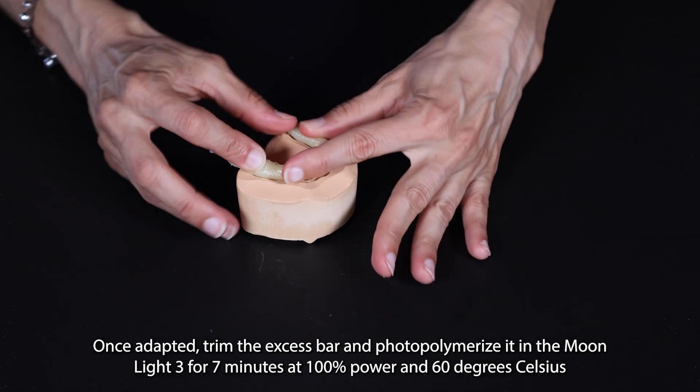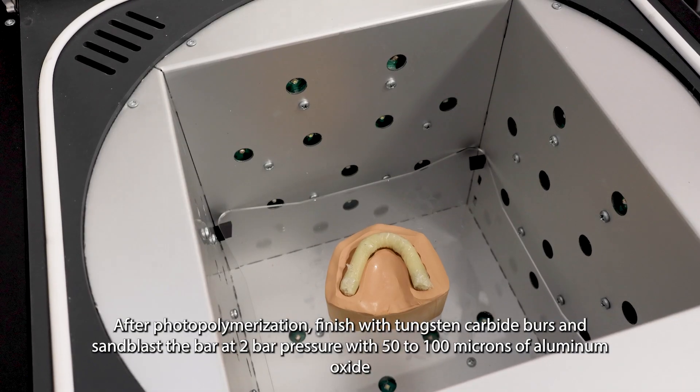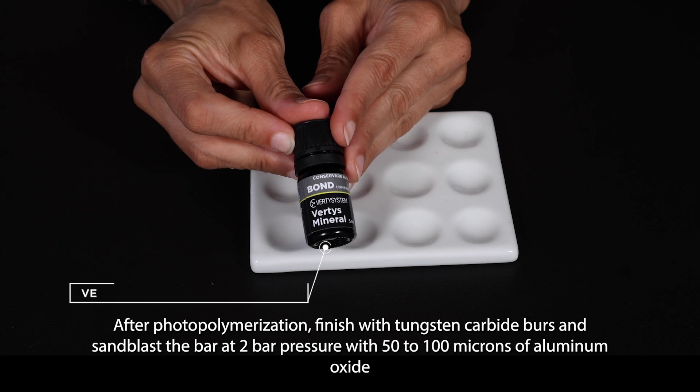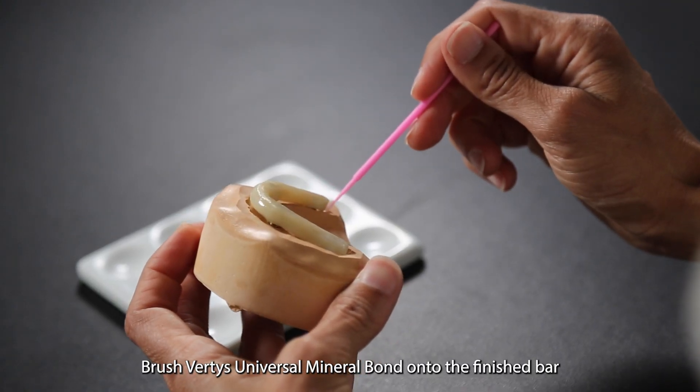After photopolymerization, finish with tungsten carbide burs and sandblast the bar at 2 bar pressure with 50 to 100 microns of aluminum oxide. Brush Vertis Universal Mineral Bond onto the finished bar.